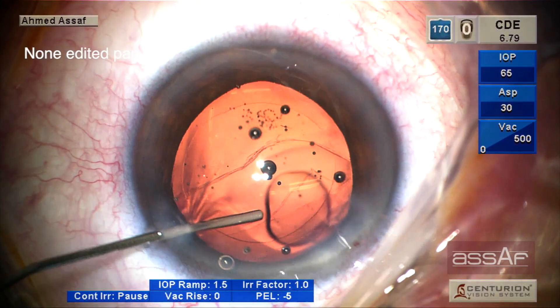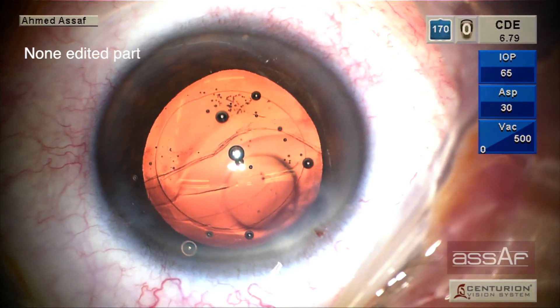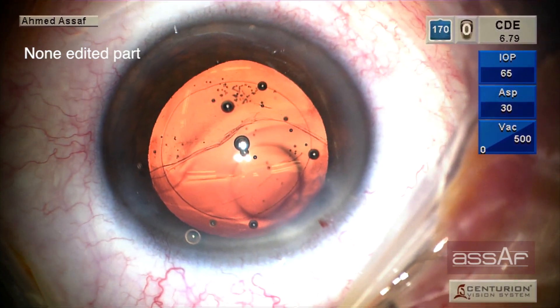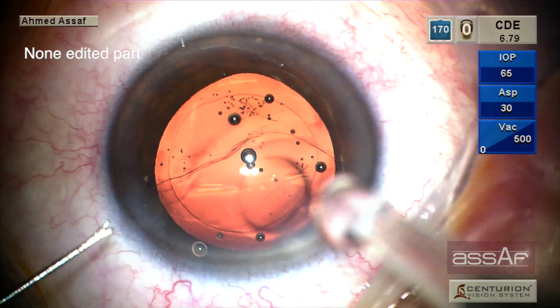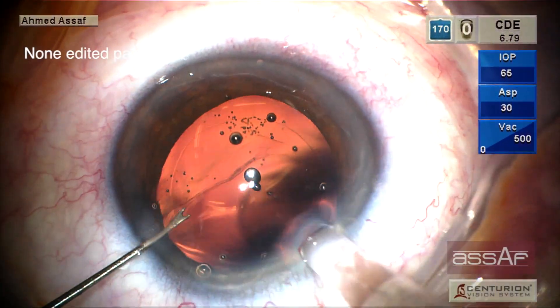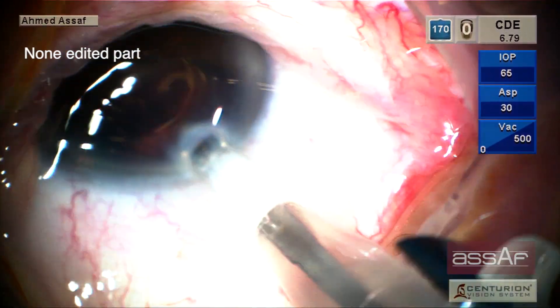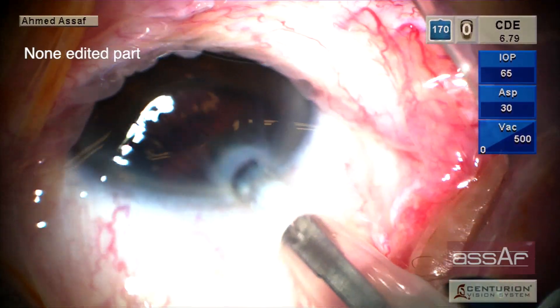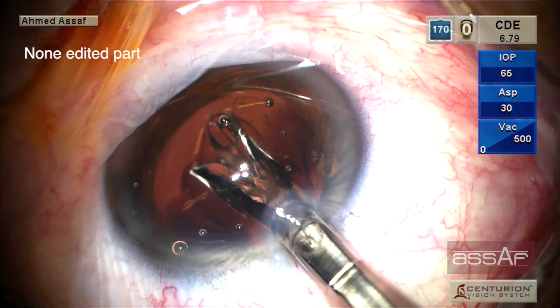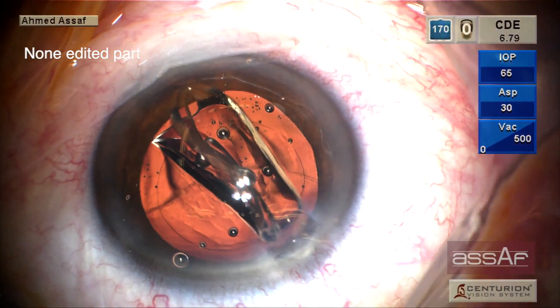This is the non-edited part of the surgery, and you can see here I'm injecting more dispersive OVD, trying not to disturb the anterior hyaloid face, because I believe at that time there is no vitreous inside the anterior chamber. I decided to continue implanting the single-piece IOL through the 2.2 millimeter incision as planned, because the lens was already loaded inside the cartridge and the injector.